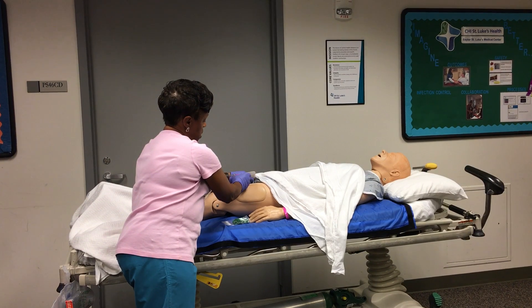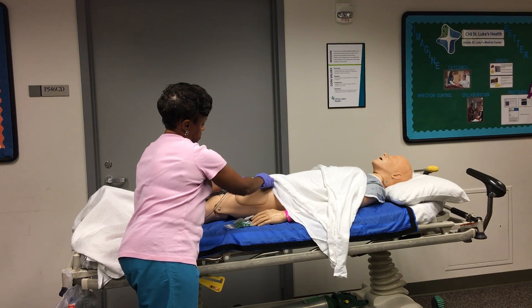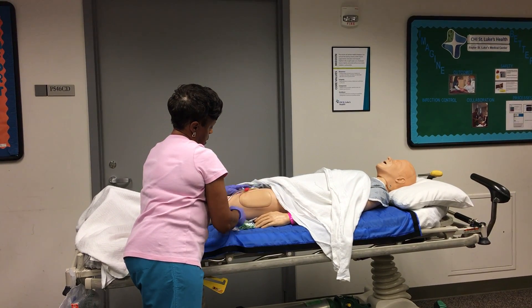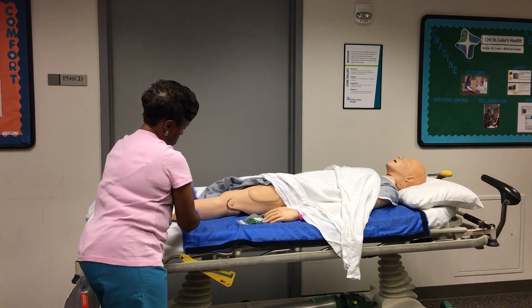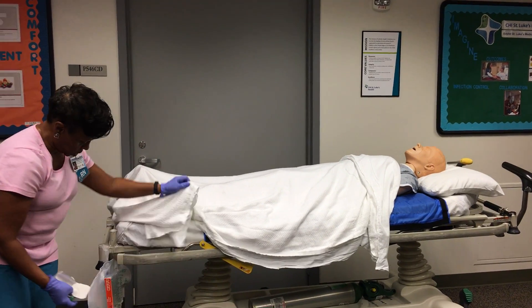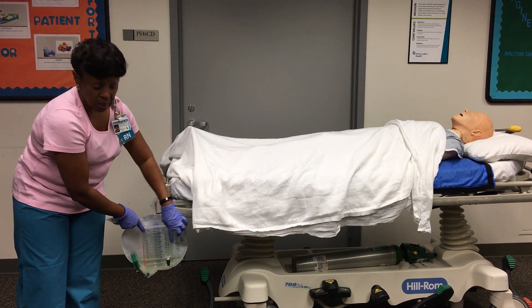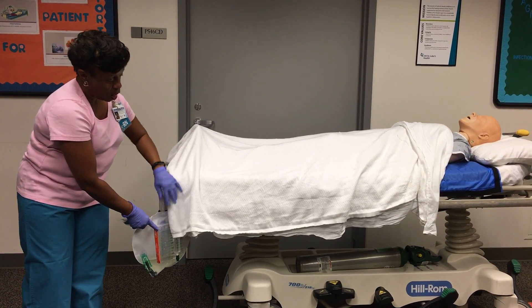With this, I'm going to place Kelly's catheter on his thigh, topmost part of the inner thigh. I will position his tubing toward the middle. And now I would expect to see either slow or fast continuous dripping into my urine meter. That is considered unobstructed flow.